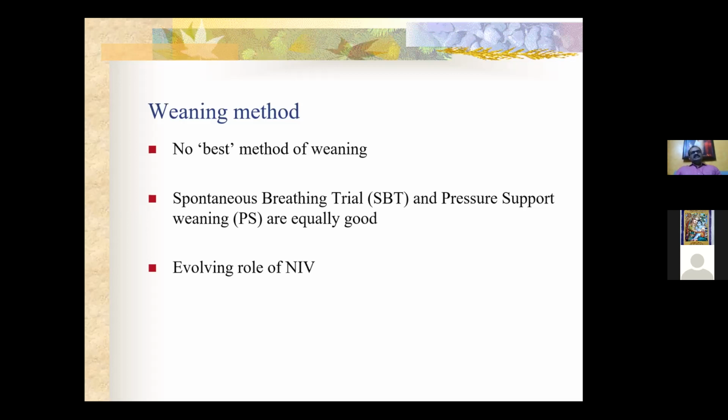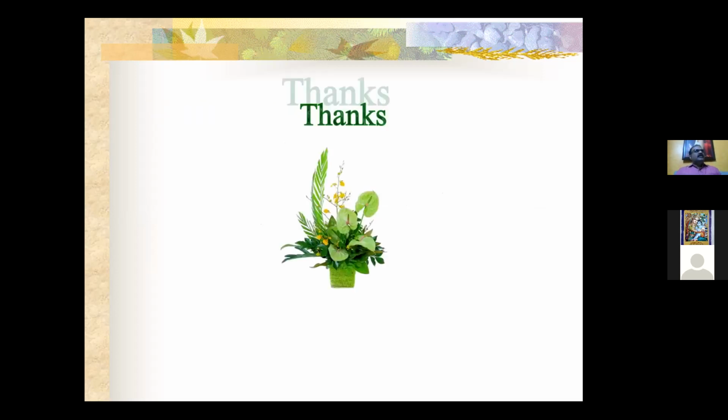If the settings are low in pressure support ventilation, especially in case of COPD and all, we might usually go for an extubation and put the patient on a non-invasive and take the patient out from there. So these are the basic weaning modes we now use: pressure support ventilation or spontaneous breathing trial, and in many cases, non-invasive also. That is basically about non-invasive and invasive type of ventilation.